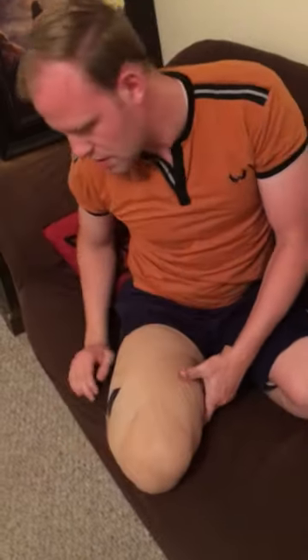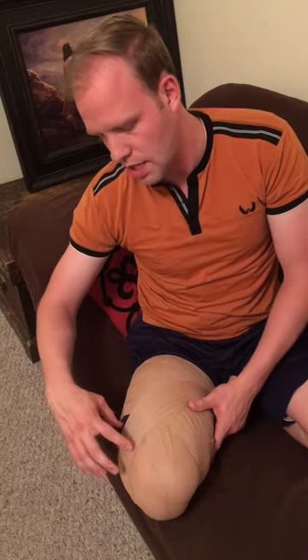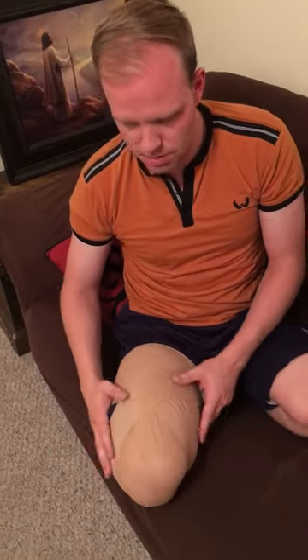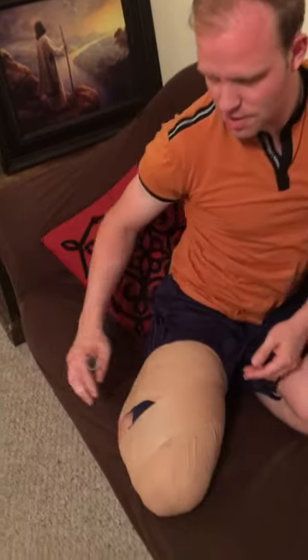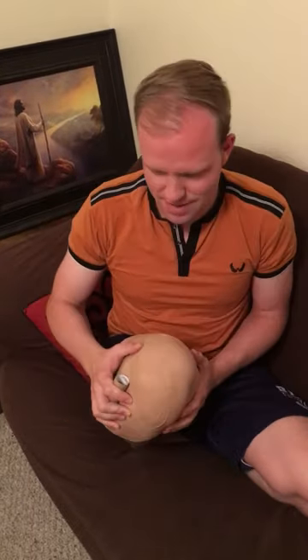As you can see there is a little spot right here that's showing. I think that if I had the proper width — it should be wider than this — then that would be covered. I could also have done it a little bit smaller but with this type of stuff once I put it on I'm not able to undo it and redo it. So look at this side, everything is covered; this side it's not covered. So there is an amputated leg that's been wrapped.